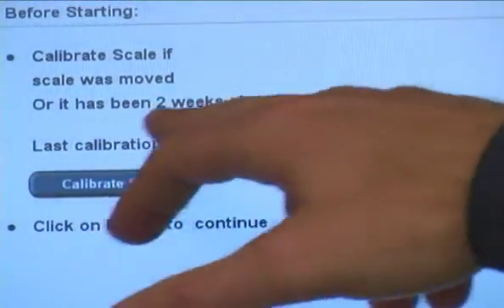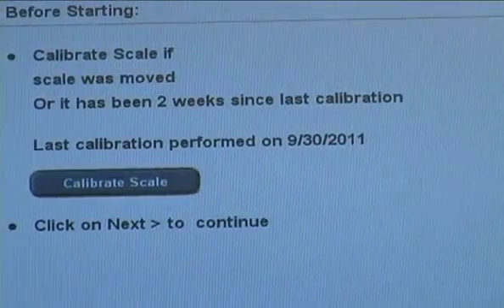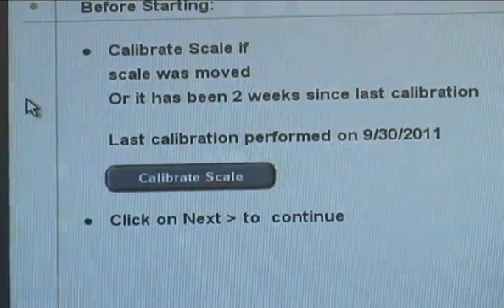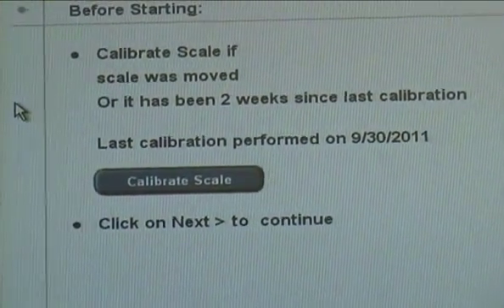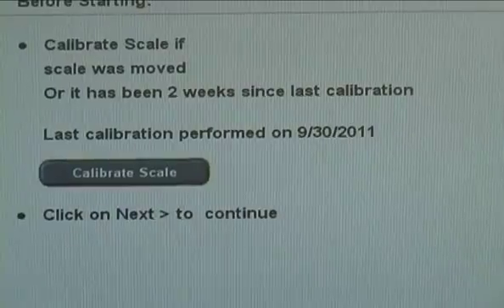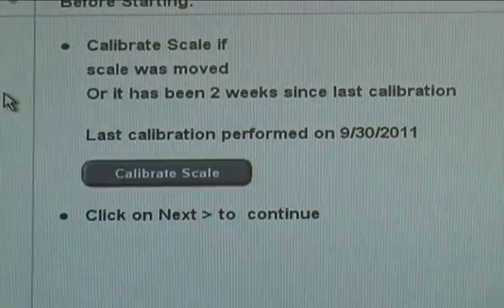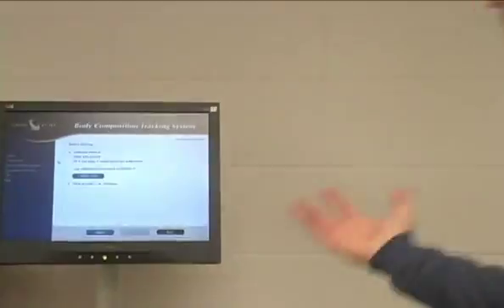If it has been 2 weeks, and it says 2 weeks or greater, then it wants you to calibrate it, and you would just click on Calibrate Scale. So it's not an automatic part of the process, it's just every 2 weeks? Exactly. It will be a part of the quality control, which we go into later. So you shouldn't have issues with this unless you're on a break. If you're on Christmas break, you come back, and you forget to do the quality control, this is where you can do the Calibrate Scale portion. So click Next because that date's good.